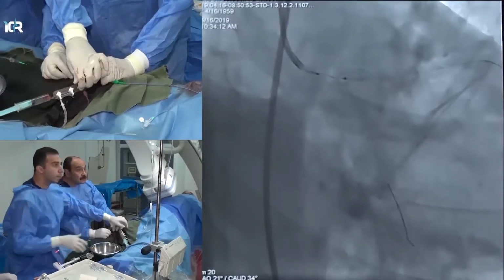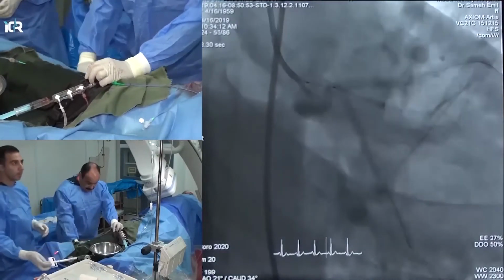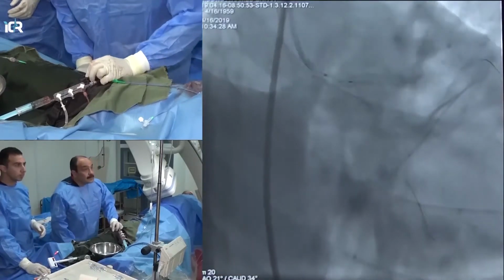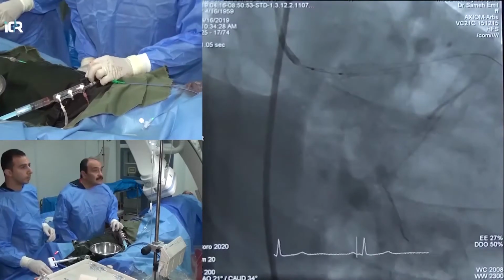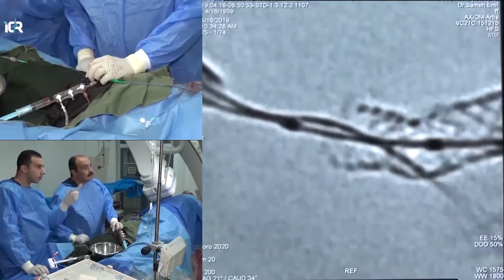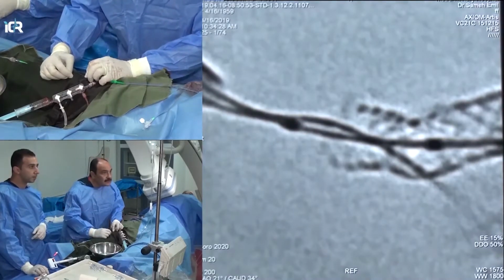Okay. We can have StentBoost to see this technology of Siemens, the clear stent technology. We'll see that the dots of the balloon are not crossing outside. Okay, we can go inside a little bit.